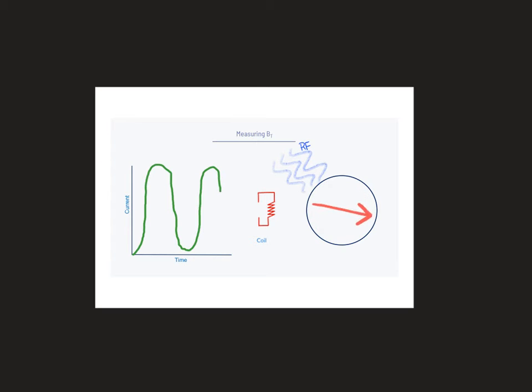Of course, I'm going a little bit faster than the arrow is spinning, but you get the idea. So for example, right now, when it's right here facing the coil, that's at its highest. It'll be at its peak. And that's how we measure the transverse magnetic field via a graph and a coil. The radio frequency electrical current in the coils is detected and analyzed using high-speed electronic circuitry.